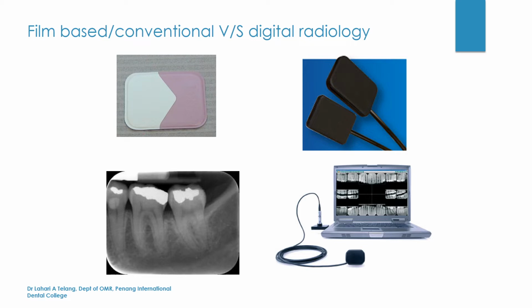You see the same image of almost similar clarity and resolution. It's just that a film-based image is a film which you can hold in your hand, whereas in digital radiology, you're looking at it on the computer screen. Let me remind you all, dear students, that you still need X-rays to expose the film or the sensor in order to capture the image.